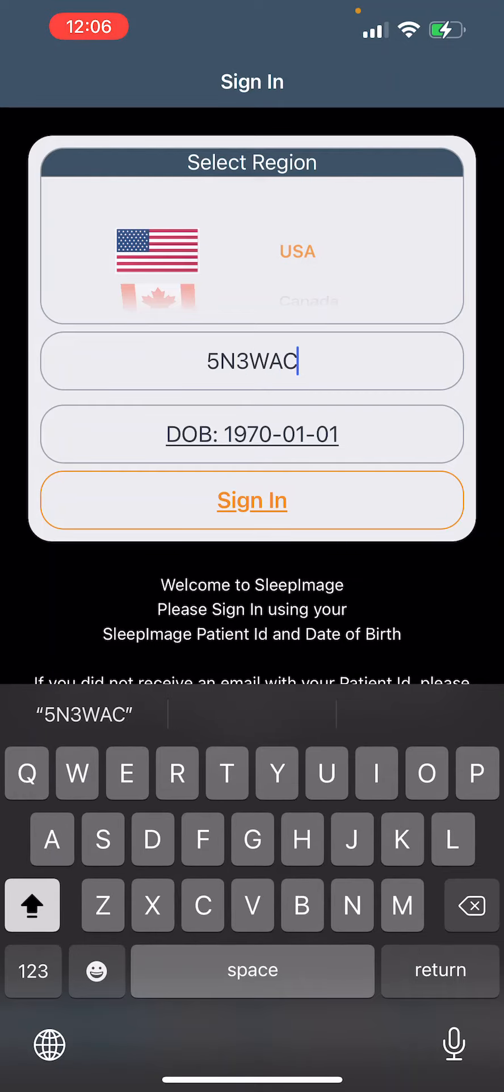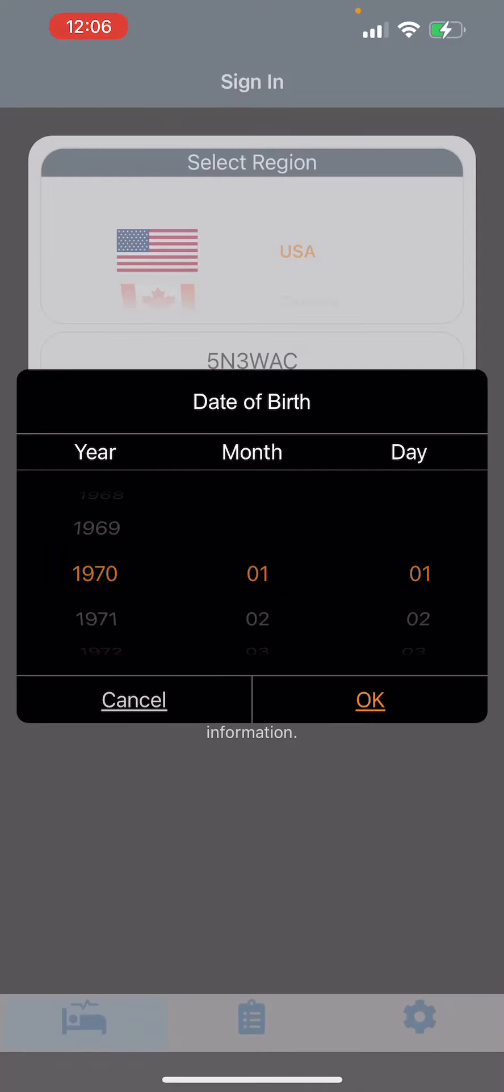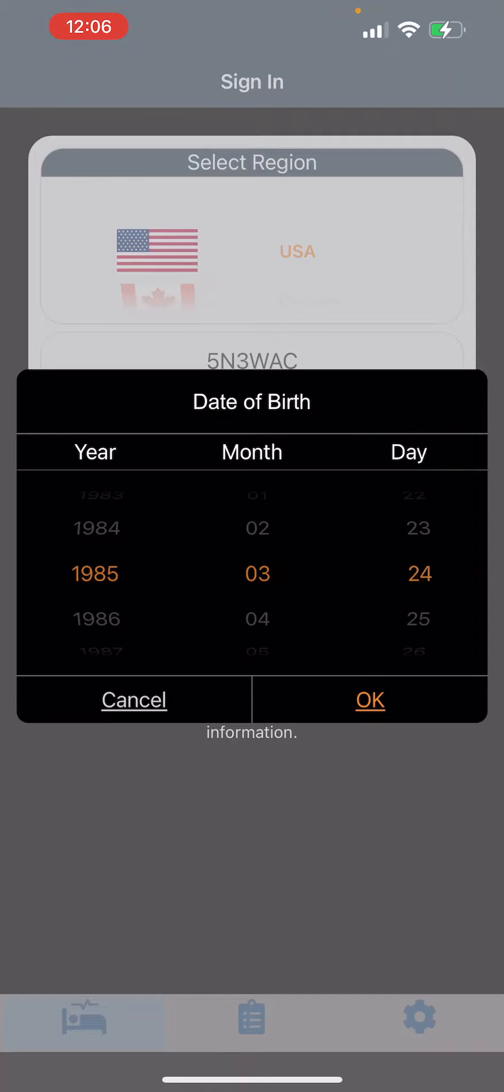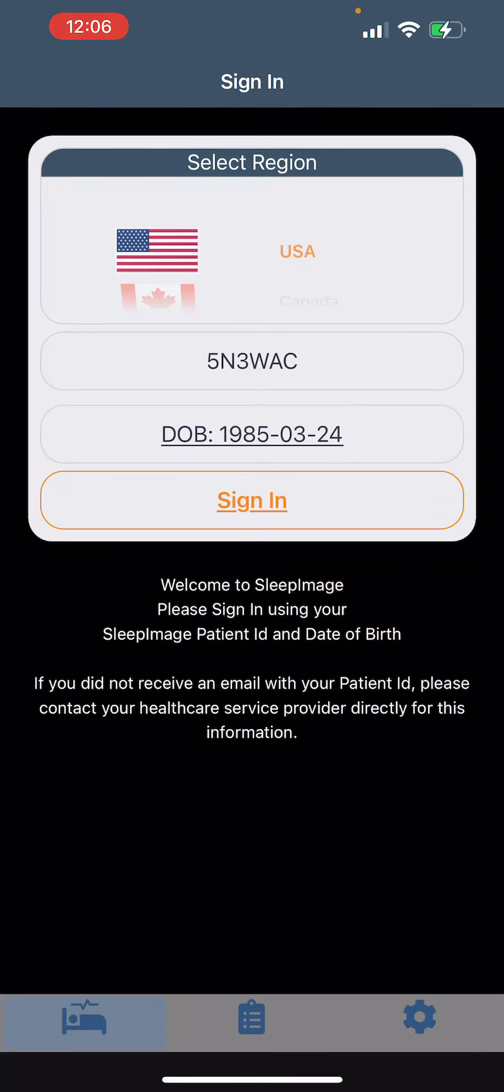Next, you'll put your date of birth in. Click OK and then go ahead and sign in.